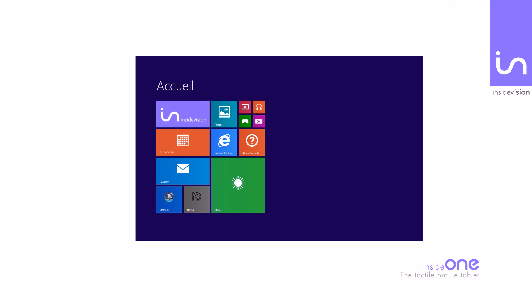InsideOne is a braille PC tablet working under the Windows environment. To access it, major screen readers such as JAWS, NVDA, Window Eyes, or Supernova can be used.